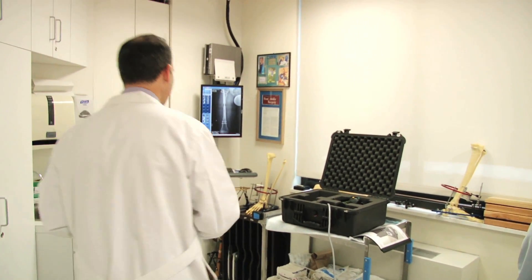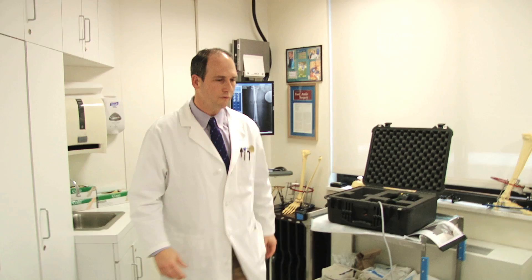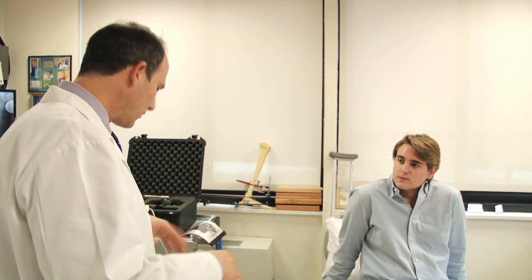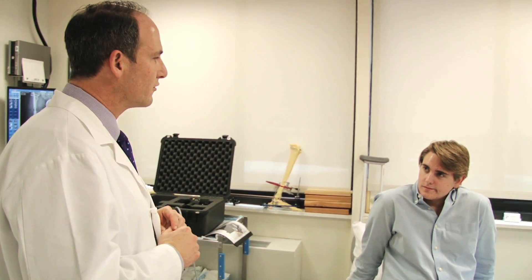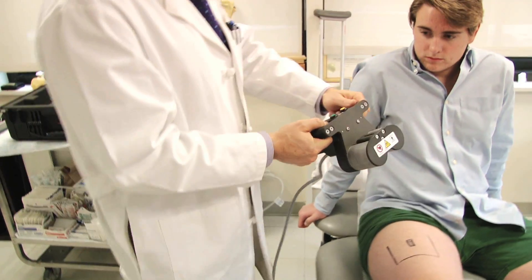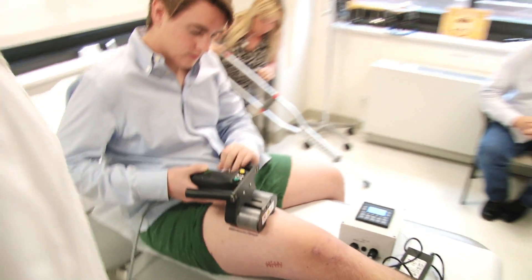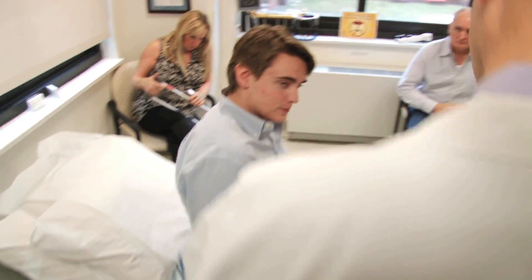You should get rid of credit cards. If you have a relative who has a pacemaker, keep them away, because magnets can affect all of those things. So get rid of the metal objects and then you're good to go. So how much does that weigh? I would say about three pounds — so it's not real heavy.